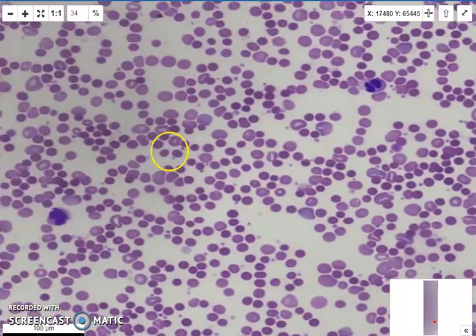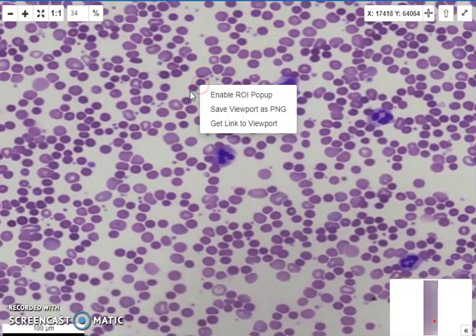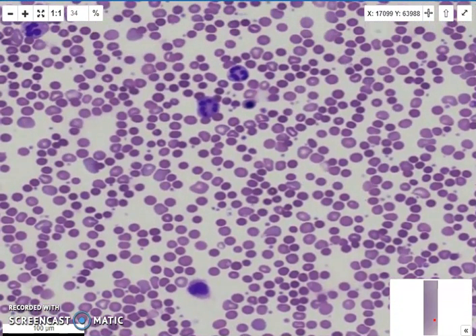The spherocytes are a lot more marked, the spherocytosis. Small, perfectly round. No central pallor. They are all our spherocytes. We have a left shift again. So the degree of hemolysis is a lot higher. I have nucleated red blood cells.